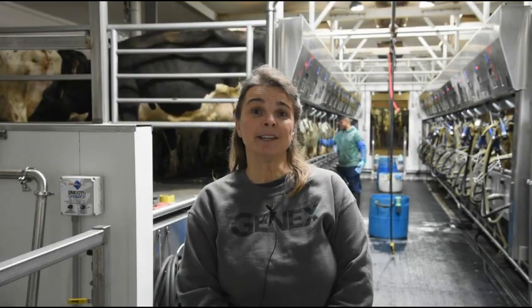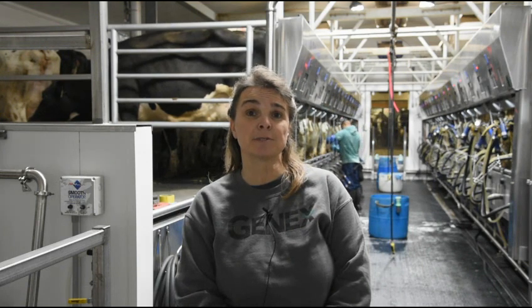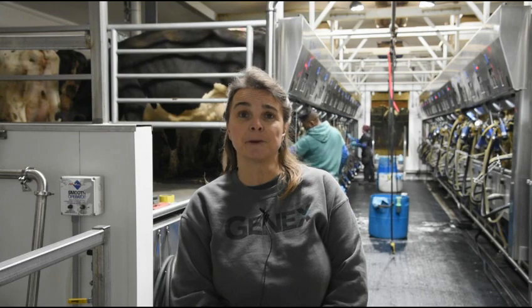Hello, I'm Dr. Kim Egan and today I'm going to demonstrate the proper application of UdderLife OptiShield Teat Sealant from GenX. UdderLife OptiShield is a dry cow teat sealant administered after the last milking to help prevent intramammary infections during the dry period.